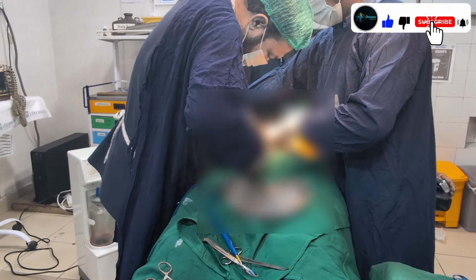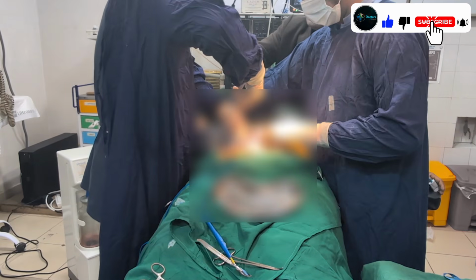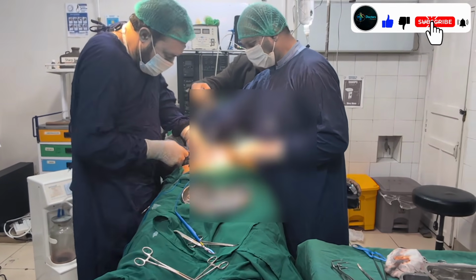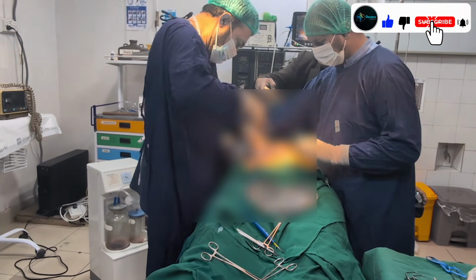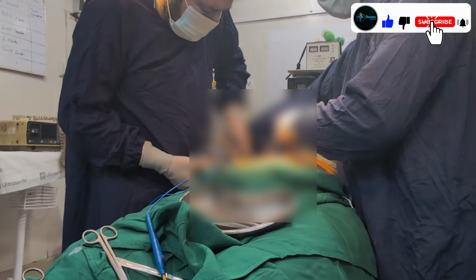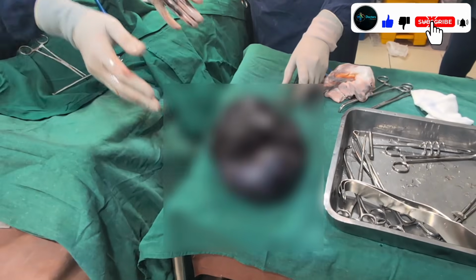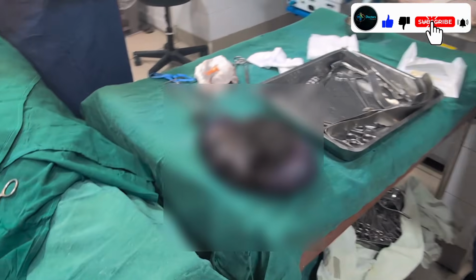The ultrasound suggested a perforated appendix, but this turned out to be something completely different. The surgeon made a very good decision by giving a midline incision. As you can see, clamping has started. The blood vessels are being clamped and the team is trying their best to remove this mass safely. It looks like a cyst, but we will know for sure once it is completely removed.